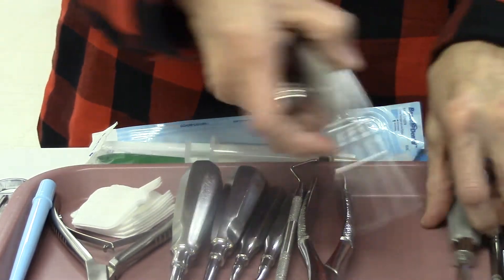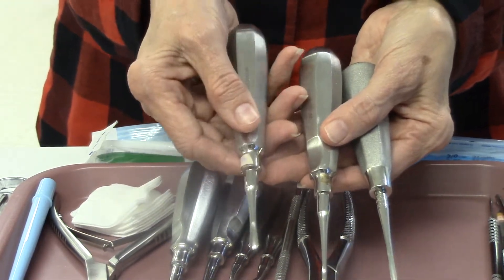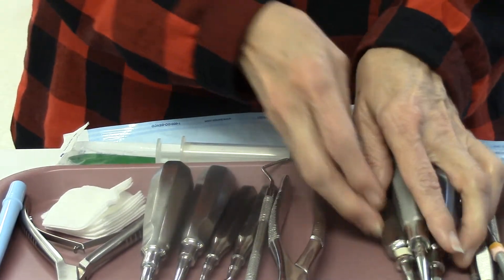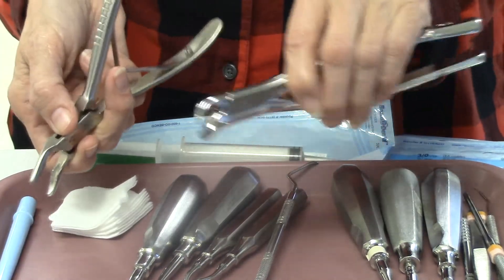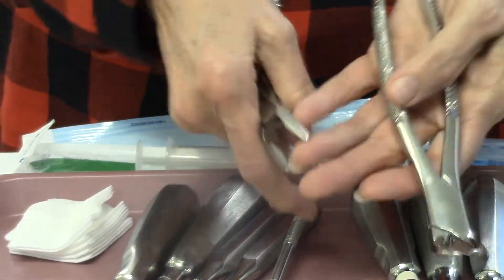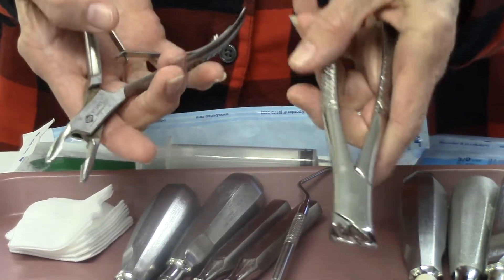We have our three elevators — small, medium, and large. You can see the tips are much different in sizes from each other. We have a forcep — this is the cowhorn forcep. You may use a different type of forcep depending on your doctor, but for this purpose we're going to use the cowhorns.